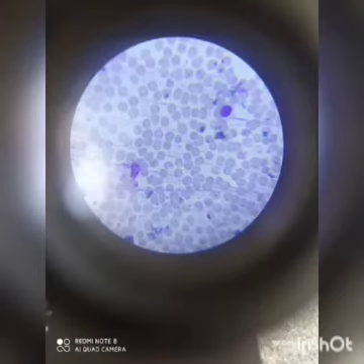Draw a table of 100 squares for recording various WBCs. Now start from the upper corner of the smear and move slowly to the right. Identify and enter the WBCs as they are encountered, counting the cells in a line until you reach the other end of the smear. Now move 2 fields down and scan the film in the opposite direction, continuing the identification of WBCs and entry into your table.